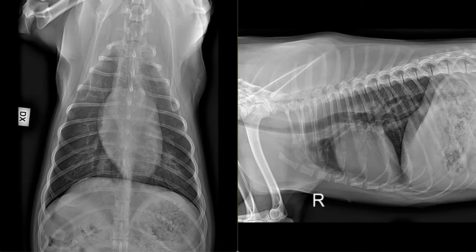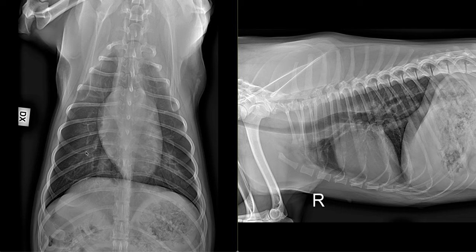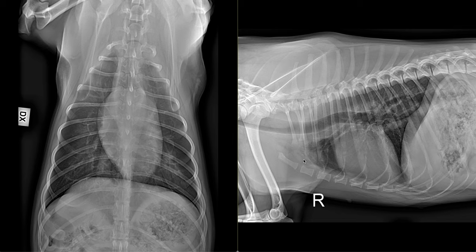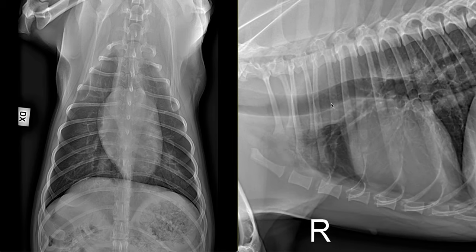We observe that in all lung fields, but worse both caudodorsally and on the left when compared to the right, there is a mild to moderate increase in soft tissue opacity, which partially to completely obscures some of the fine vascular markings and can create air bronchograms. The caudal lobar vessels are near completely obscured by this process, where cranioventrally the distribution is more patchy and certainly left-sided. This is the right lateral view, which allows for improved inflation of the non-dependent left lung, and this is the patchy change we observe in the cranial subsegment of the left cranial lung lobe, evidenced by an air bronchogram.